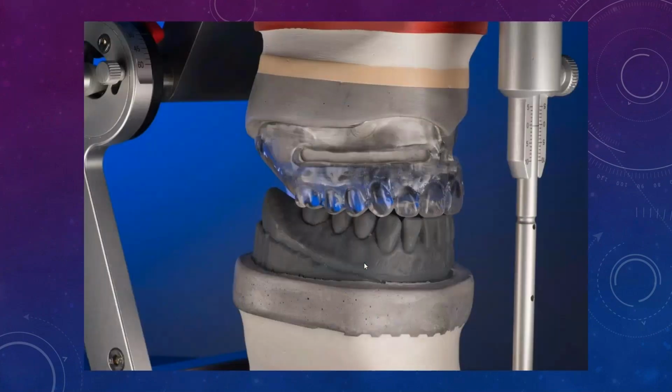And this line right here, I've changed it a little bit since then. I used to just do this window, but a lot of times doctors would question and go like, well, do we go to the bottom of the window or the top of the window? So what I started doing as of late, I just started cutting it to about right here, so they know this is the only place to cut to.